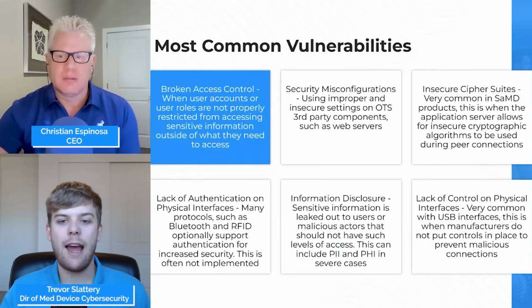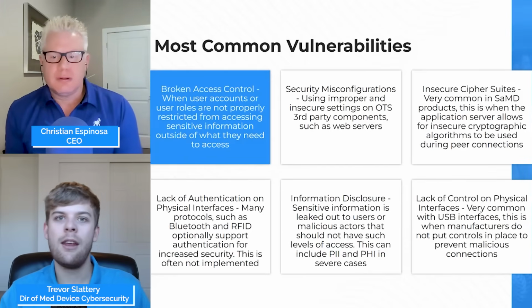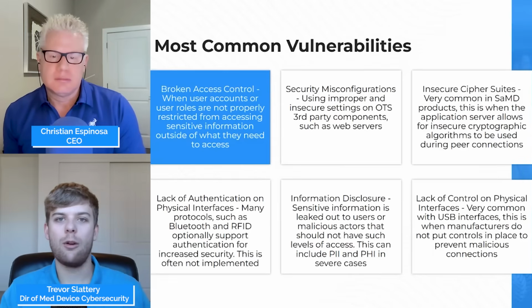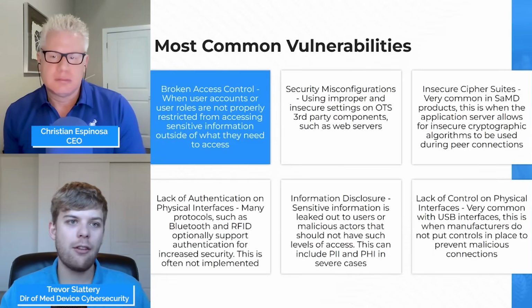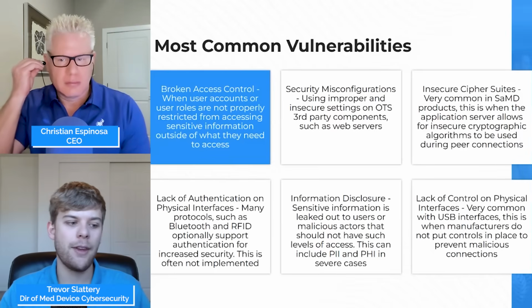So what we want to do at that point is say, hey, we know what this device is. This is a certain USB flash drive that has that update package. We're only going to allow this USB flash drive. We're not going to run anything that's on there. We're going to verify that that update package is legitimate when we plug it into the device. All of this needs to go into consideration when we're trying to secure a USB interface.